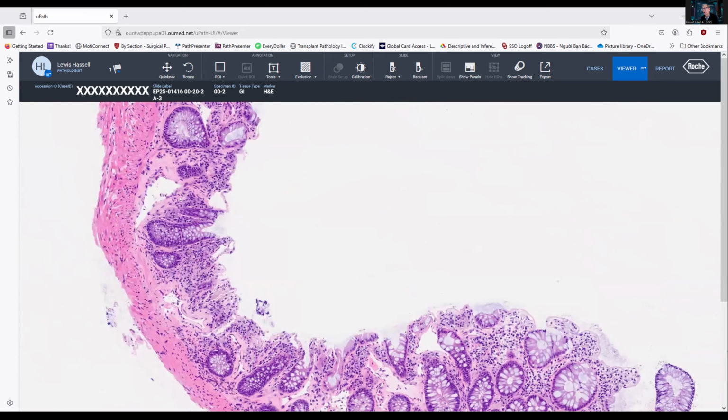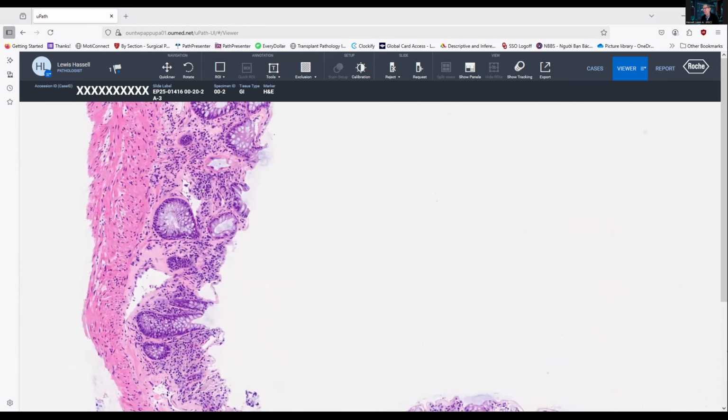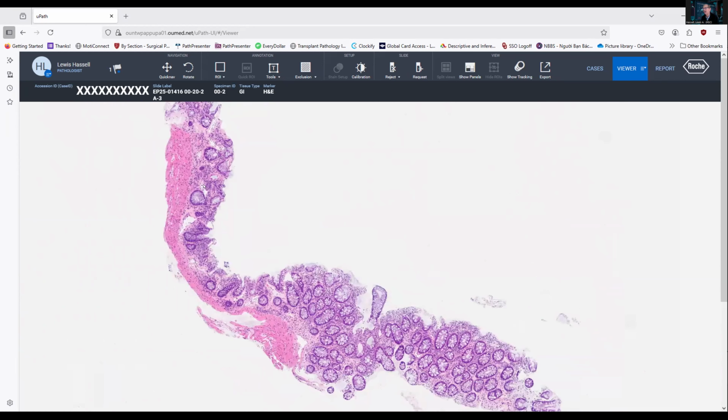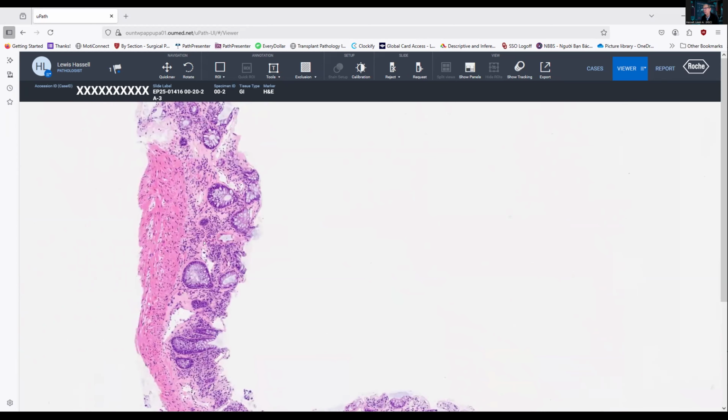But I emphasize here that it's only easy if you're aware of the history and you know to be looking for this subtle kind of change. If this was a rule out polyp, I might not have even gone to high magnification because with that diagnosis, I'm primarily looking for coloration changes rather than these subtle, slightly dilated vessels here that just barely begin to make their appearance here towards the edge of the sample.